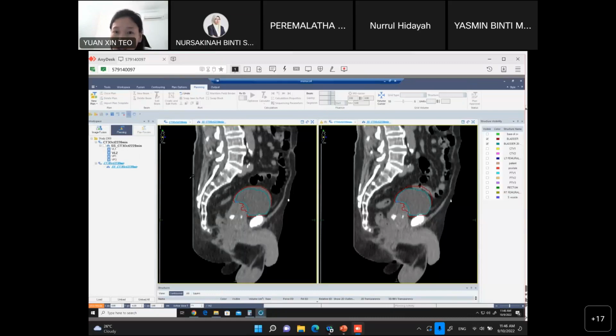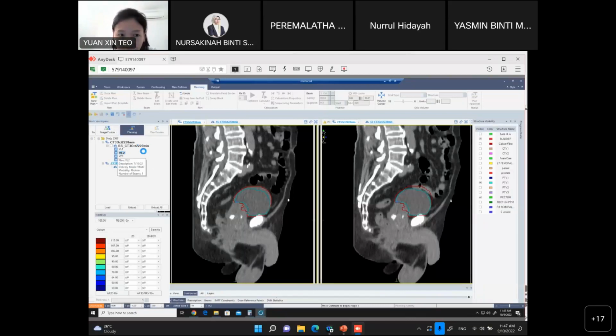Means the patient no need to wait until 30 minutes to treat. So in this kind of arrangement, the patient can save waiting time of 10 minutes. Okay, understand? So for this plan, we will directly use the 20 minutes to do a remap plan.